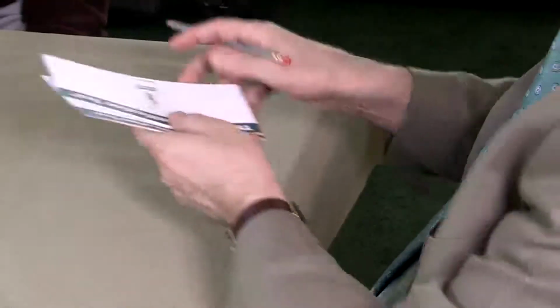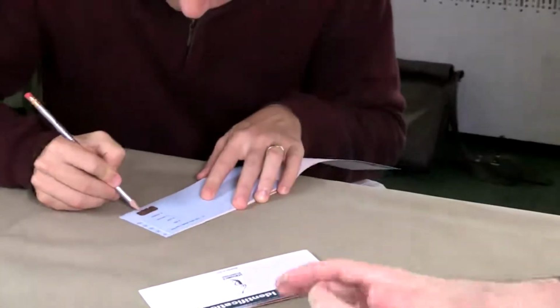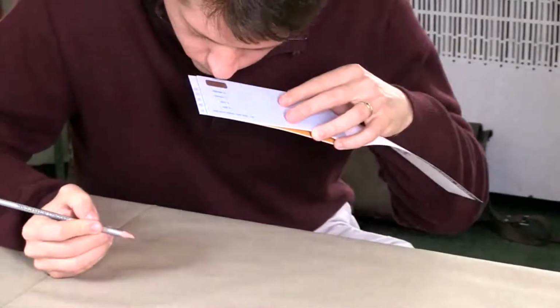Sometimes when people self-administer this test, they skip over an odor, don't notice it, or forget to fill it in, and that invalidates the whole test. So you need to really have an answer for every item. Okay? You can do the final 2, and then we'll score the test and go from there.